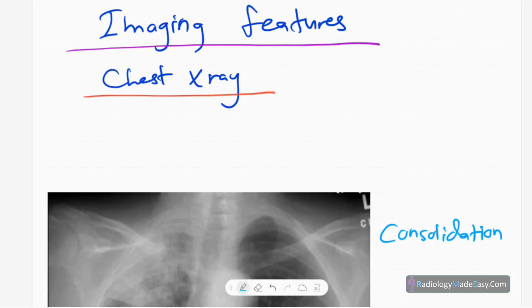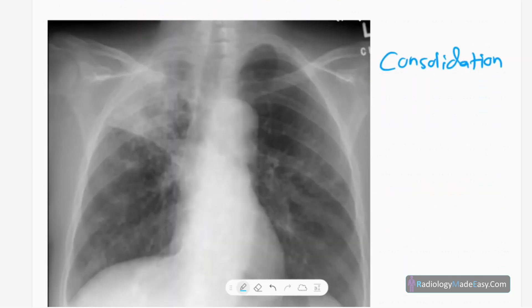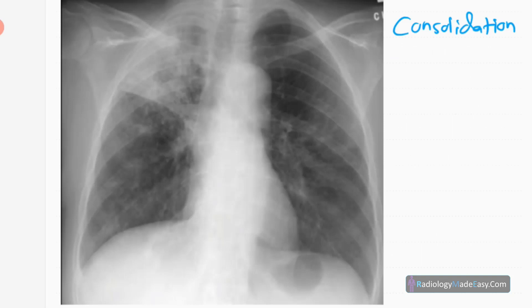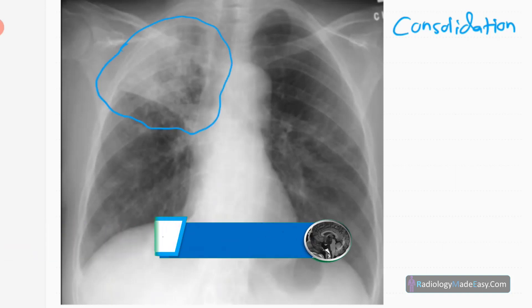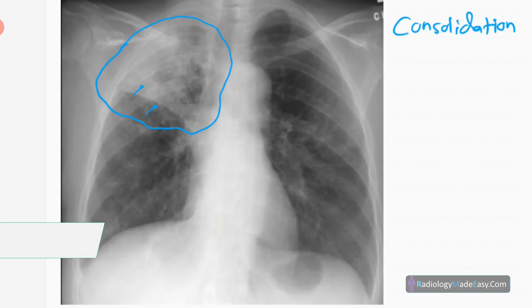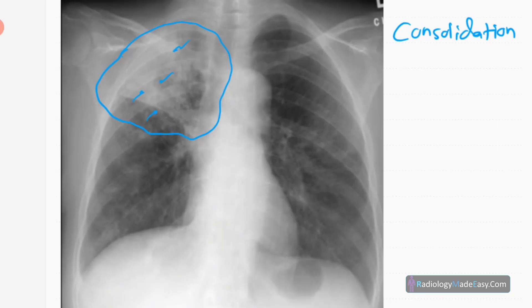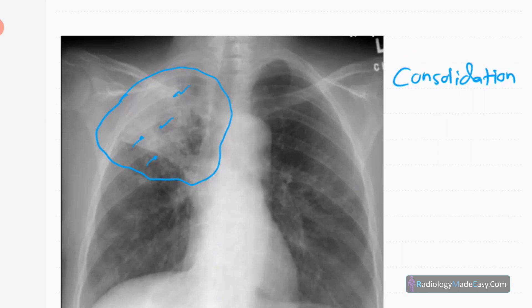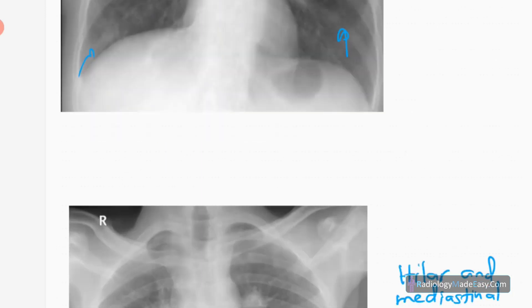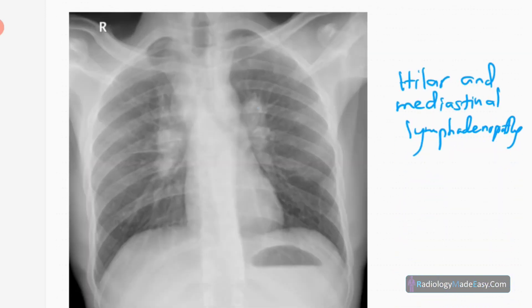Now I'm going to discuss the imaging features — the main idea of this Radiology Made Easy series. First, chest X-ray features. This is the frontal chest radiograph of a young patient. You can see inhomogeneous opacification in the right upper lobe with air bronchogram formation — it's consolidation in primary TB. There are no cavities and no traction bronchiectasis. The left lung is normal.